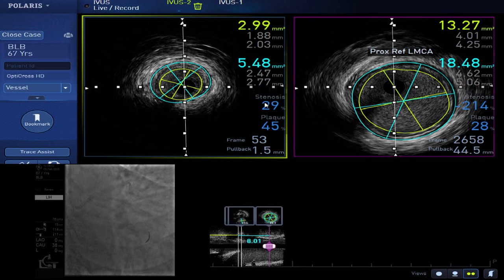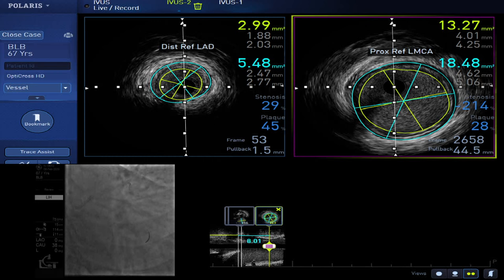Five, semi-compliant, or 4-0 balloon. Yeah, that's fine. But that is 8 you had, this is 6. But other 4.5 we will go down there, sorry. This is the non-compliant NC. 6. This previous one is? 8. We can try. You can try this.